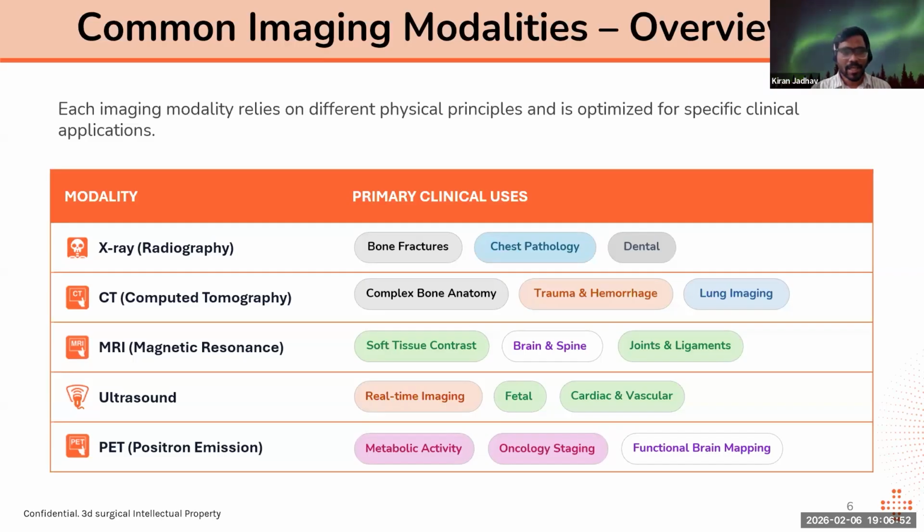That X-ray showed my condition itself. If you have a normal condition, then your lungs will appear much darker. But if you have pneumonia inside your lungs, or a cough, then that region will appear white. So these images clearly give an idea about the patient's condition, how much the deformity or pathological condition is there inside the patient. So that is about X-ray.